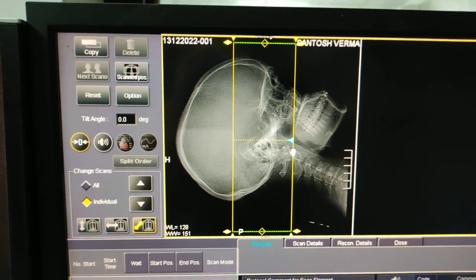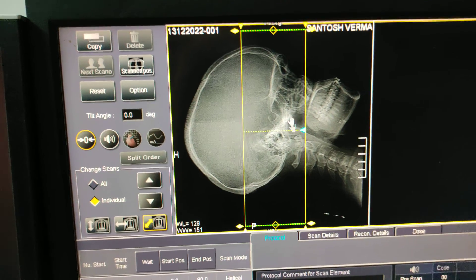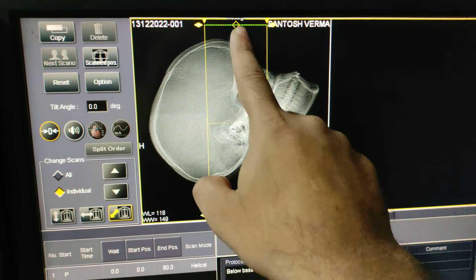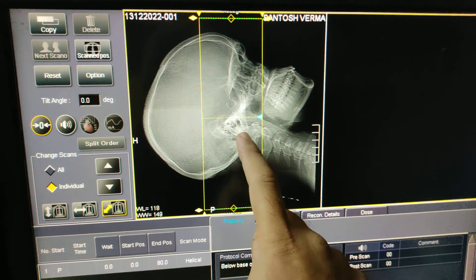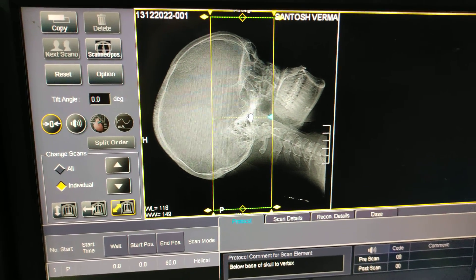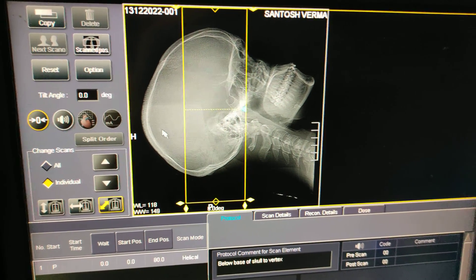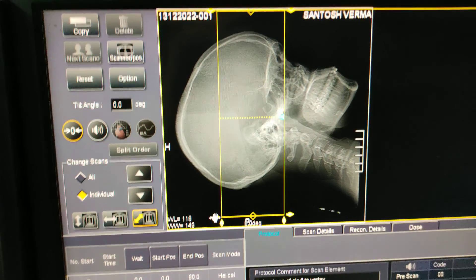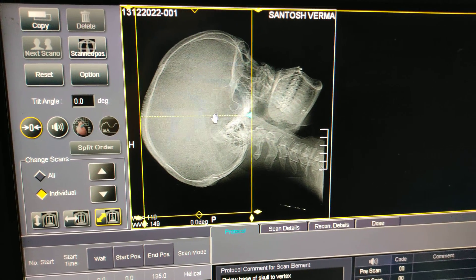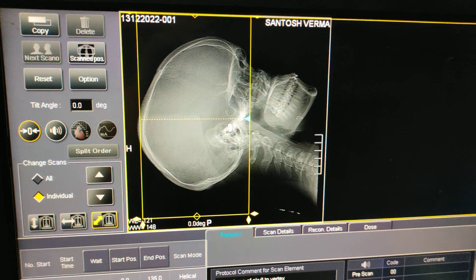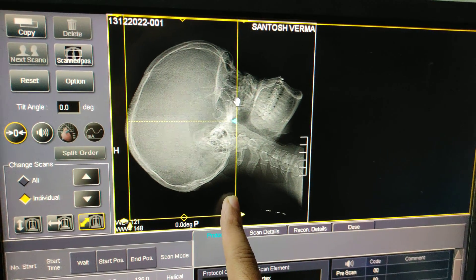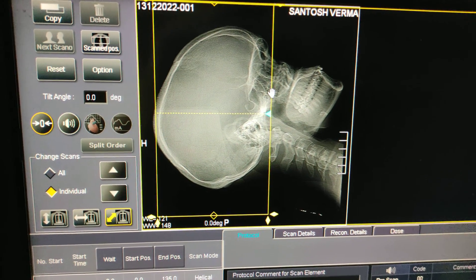Now decide how much area you have to cover in the brain. This is the base of skull — you can see this is the base of skull and this is the vertex. From here to here you have to cover the area, or you can say from the CV junction to the vertex. So this is the plan for a CT brain scan.